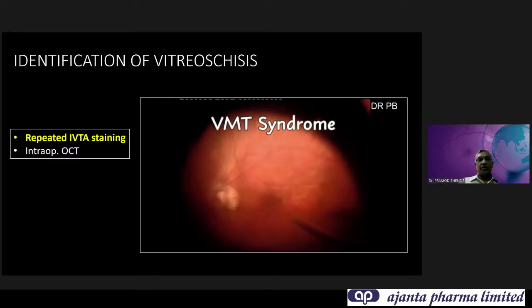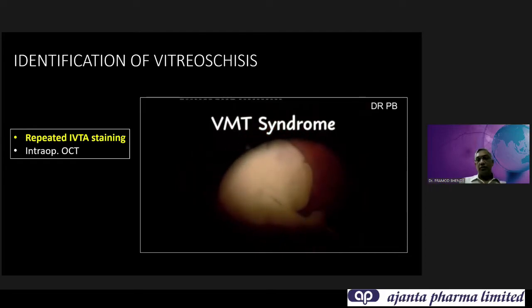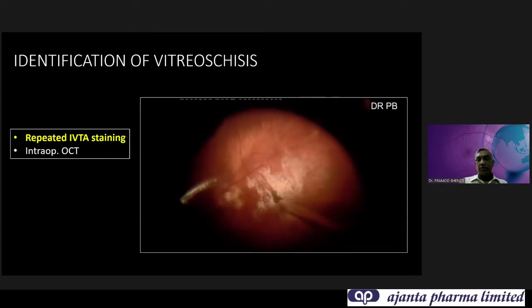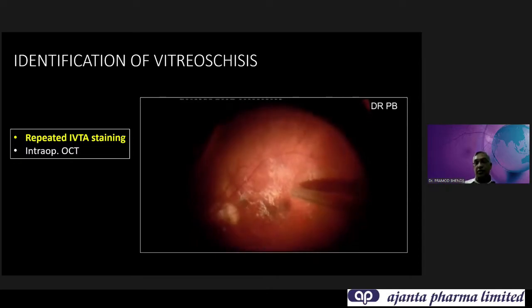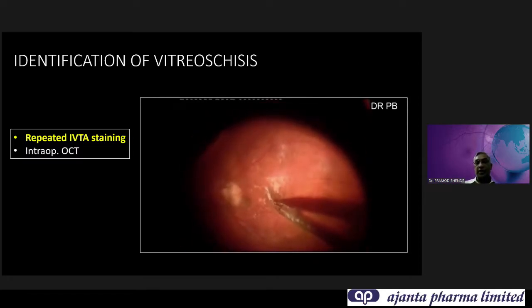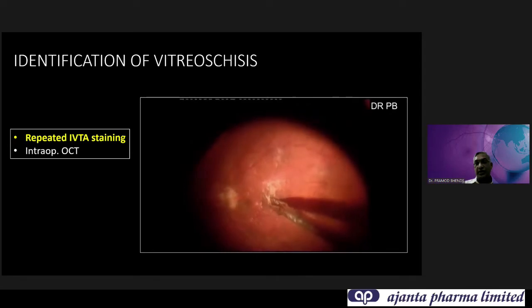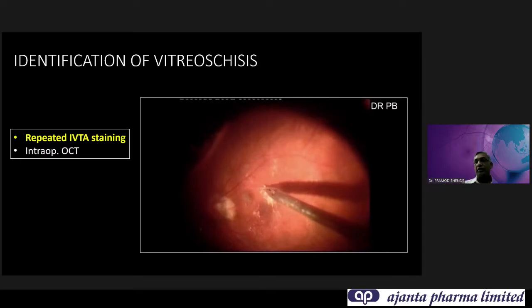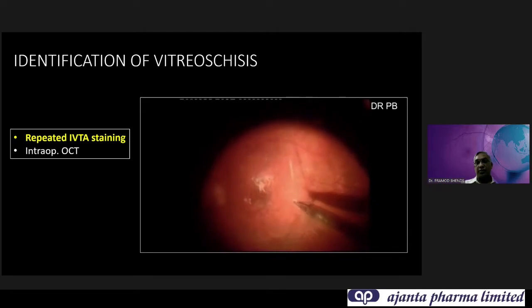It's important to identify vitreous cortex in this eye sometimes, because when you do a vitrectomy with triamcinolone, you remove the vitreous and you think everything has come out, but it makes sense sometimes to repeat the injection of the triamcinolone and look for additional attachment. As in this case, even though we induced the PVD and then put triamcinolone again, it is sticking there. So we know something is there. And see again, the entire sheet is coming up here once again. So this is typically vitreous cortex, as you are seeing here.